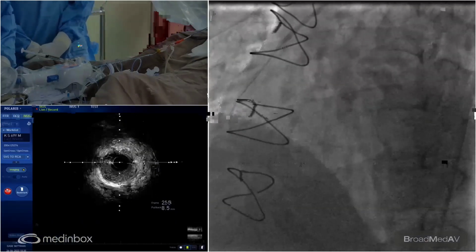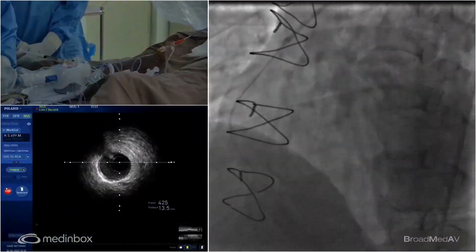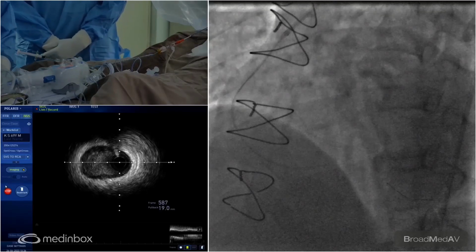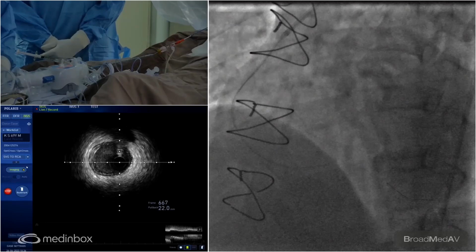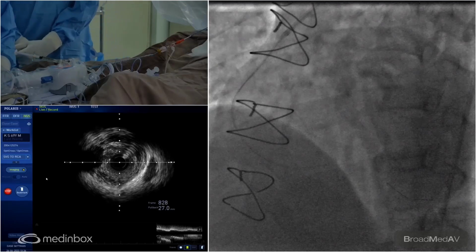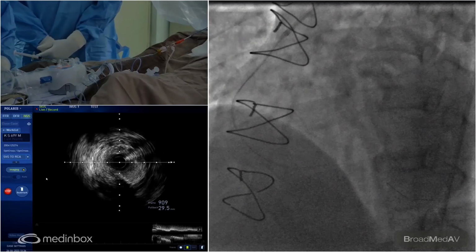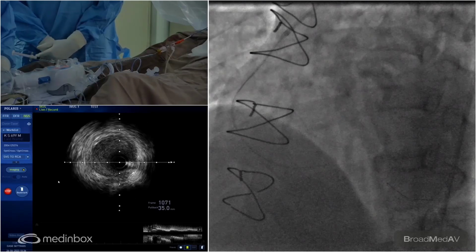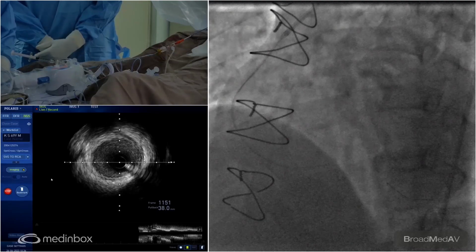The lumen appears to be normal and nominal, and we're coming close to the vein graft lesion. This is one of the branches, the PDA. And this is the lesion. You can see this was a tight stenosis lesion at the vein graft junction. It's more fibrotic, not much calcium. Again it appears to be a reasonably good sized upper vessel at the vein graft.